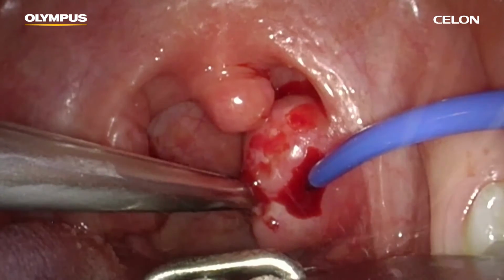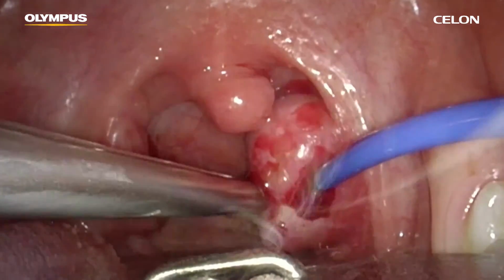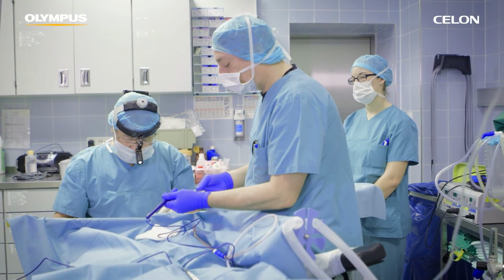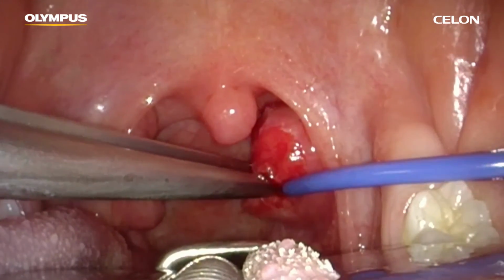Due to the soft lymphatic tissue of children, the application takes up to 10 seconds for each lesion. It might be necessary to clean the tip between coagulations. The total procedure takes about 15 minutes. Bleeding is rare and in most cases soon stops on its own.